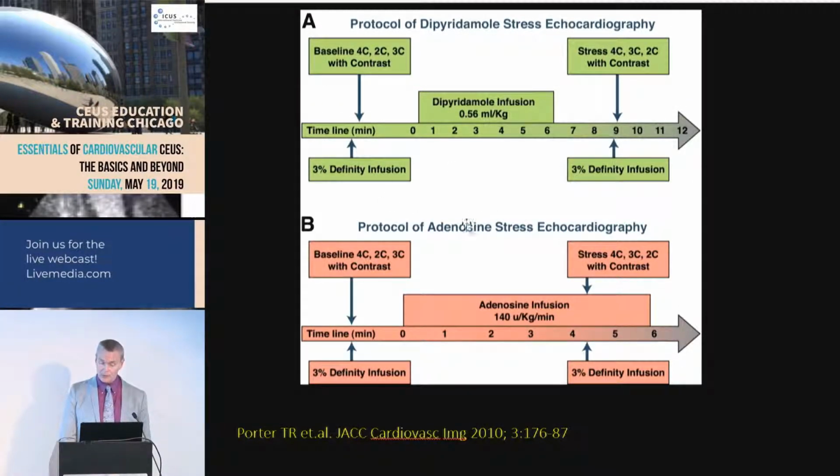But as we know now, since we have an optimal myocardial blood flow technique, radionuclide imaging has always been a compromise, right? Not just because of its cost and radiation, but its resolution is quite poor. It's around 12 millimeters. So if you have anything that causes myocardial thinning, you're going to miss defects by partial volume effects. While myocardial contrast echo has about a 2 millimeter resolution, so it can pick up wall thickening abnormalities very easily. Because remember, your normal wall thickness is about 10 millimeters. If it's dyskinetic, it can go to 8 or 7. Well, that would be missed by radionuclide imaging because it doesn't have that resolution.